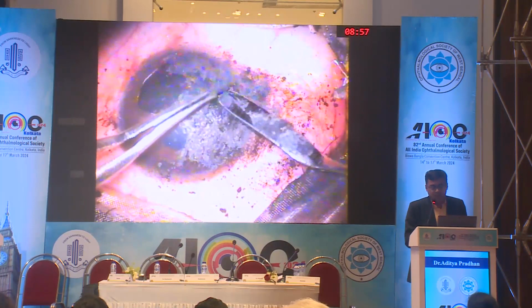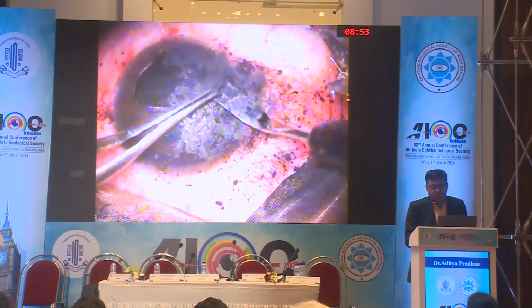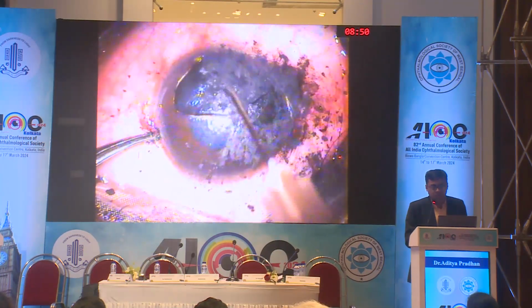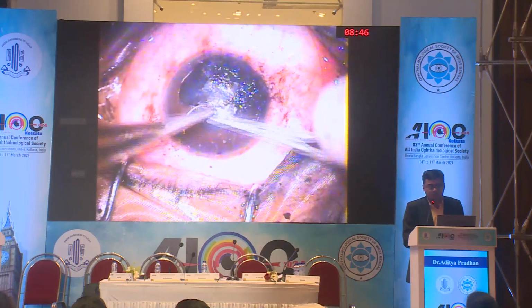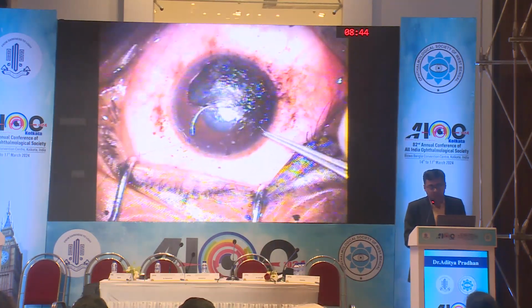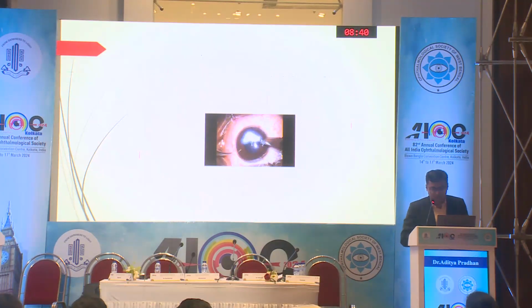Here the depth of the dissection is extremely important. One should not go too deep, to avoid any perforation into the anterior chamber. The roof of the pocket is being tackled and the suture is being applied. After the suture, you can put a bandage contact lens for better comfort.